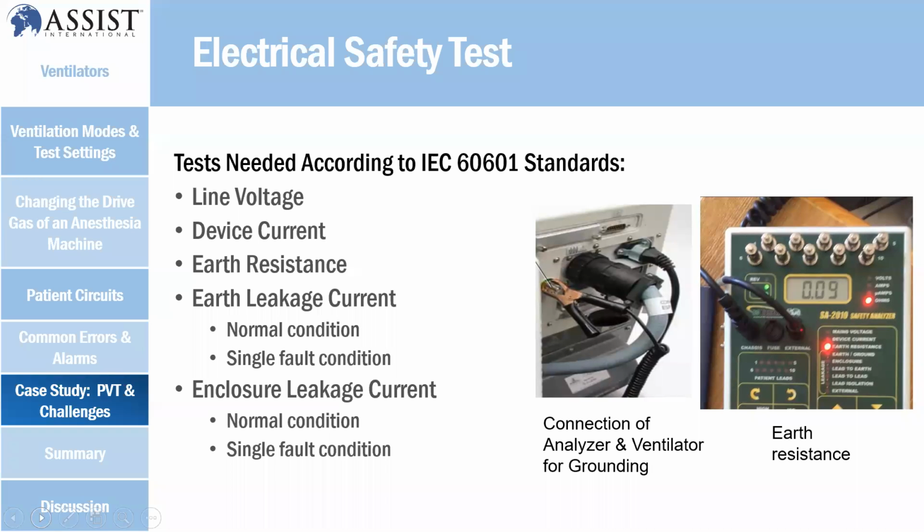Electrical safety tests: you're going to test according to the IEC 60601 standard. Everyone knows all the medical equipment follows this standard. So you're going to measure line voltage, device current, resistance, leakage current in normal condition, which I used to call NC, and SFC, single fault condition, and enclosure leakage current in normal condition and single fault. So when you see the connection here, these are measuring resistance.